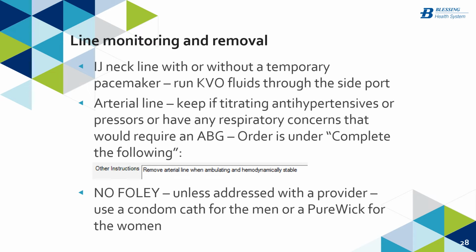Our IJ neckline or the femoral vein line, with or without a temporary pacemaker. While it's in, you do want to run KVO fluids through the side port. It is a venous line. Want to make sure it does not get clotted off. If it does not have a pacemaker in and you don't need that large bore access line for any other reason, if you've got good peripheral sites and you're coming off of any antihypertensive or pressor, that can definitely be removed prior to the patient getting out of bed, or if they're experiencing some discomfort or bleeding from the line.